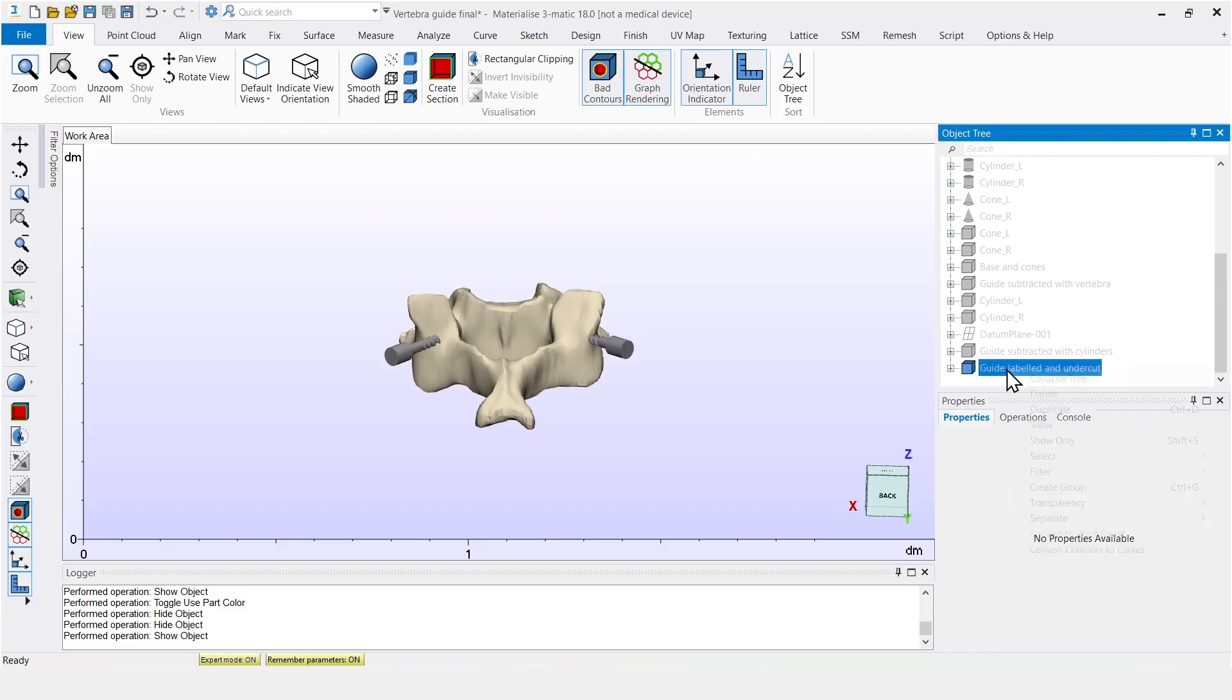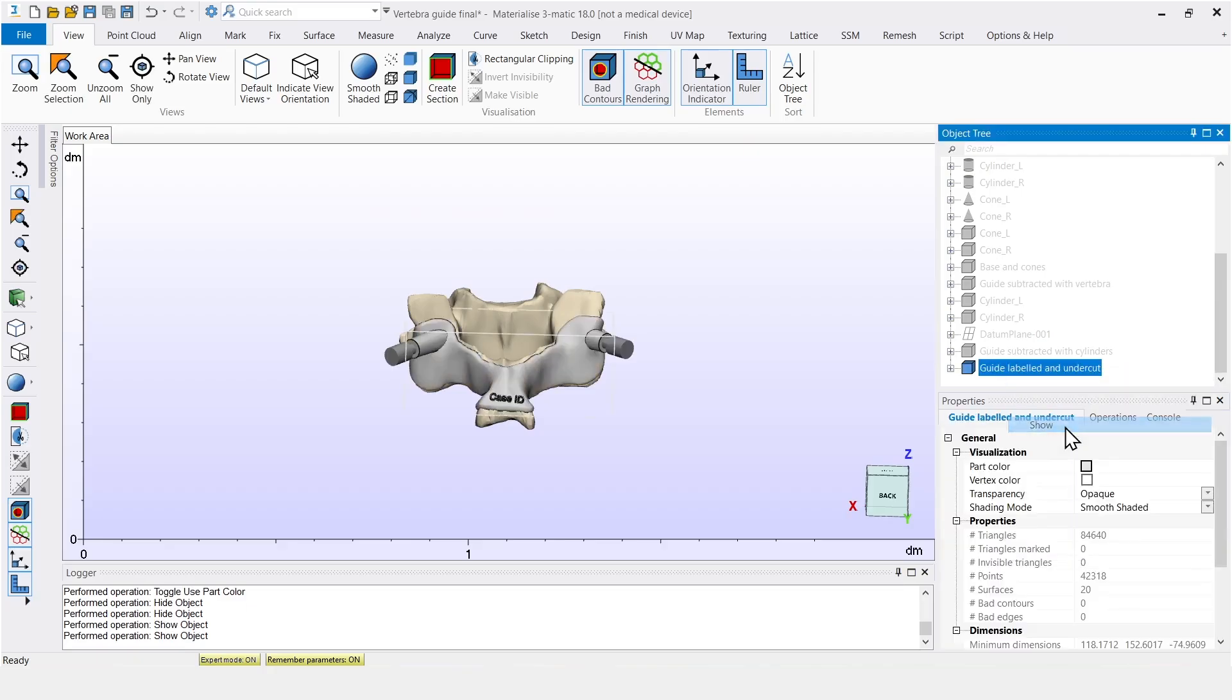With this video, my goal is to give you an idea of what is possible with scripting in Trimatic. Let's take a look at the guide. Starting from the planned position of the screws, we can design a drilling guide that looks like this.